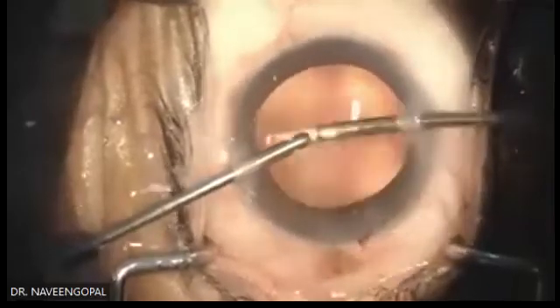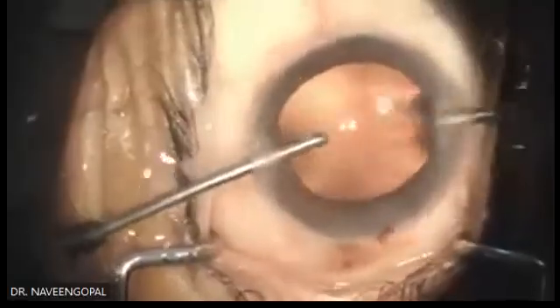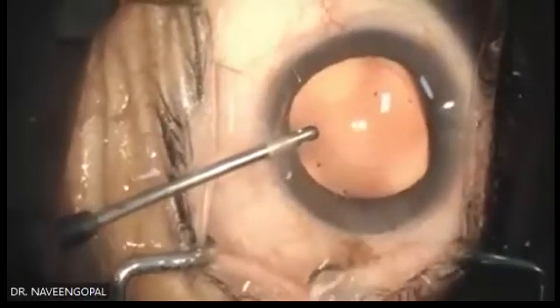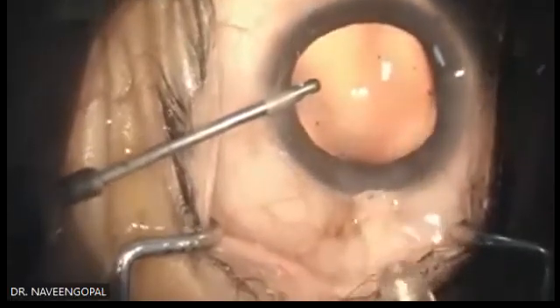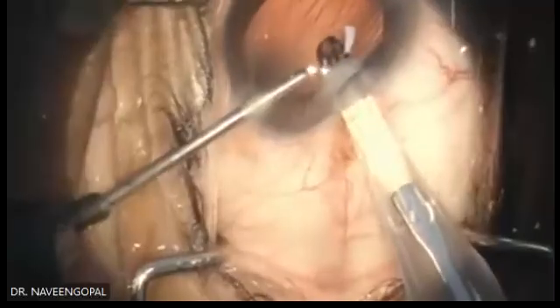Polish nicely again to the equator. I don't like to leave even a single fiber. Now I do hydroimplantation. Advantages of hydroimplantation is, I'll tell you. Put this last step now.